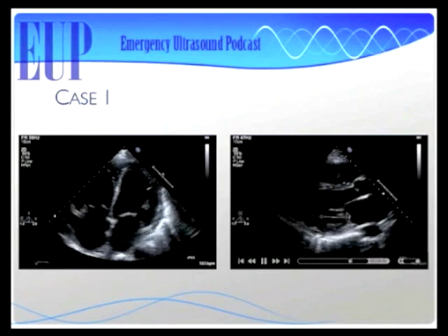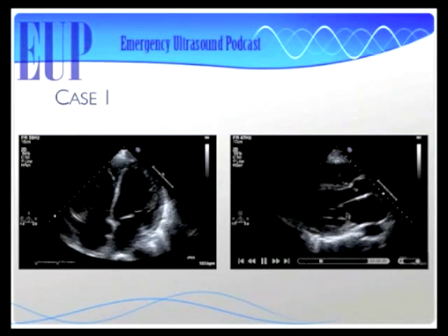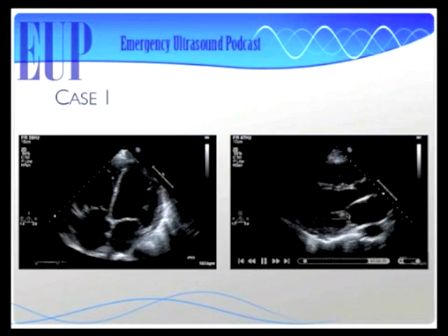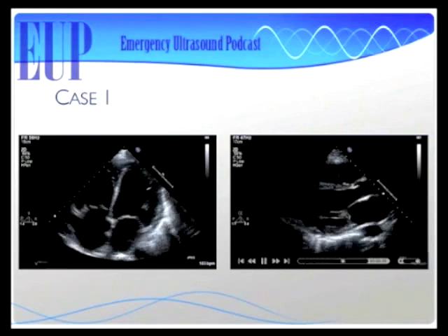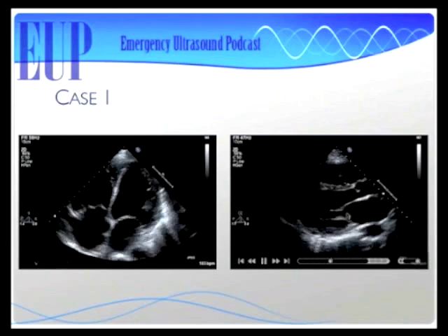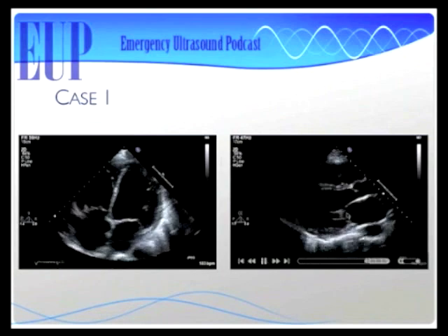If it's not opening enough, then that's a pretty good hint. So, I kind of spaced out there for a second. You said, tell me again, it's less than 30% ejection fraction if the anterior mitral valve leaflet doesn't get within 7 millimeters of the septum. Okay, I spaced out again on that sentence, but we'll move on. Hope everybody else got it.